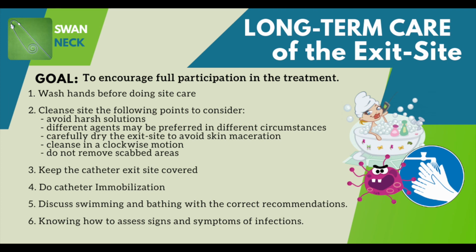To avoid torque movements at the exit site and reduce the risk of exit site infection, swimming and bathing can also be discussed with patients once the exit site is fully healed and ideally free from infection, with the following recommendations. A waterproof or occlusive dressing should be applied, and the exit site should be cleaned, and a new dressing applied immediately after immersion in water using the normal technique. Also, do not immerse the exit site in water without a waterproof dressing, particularly hot tubs, jacuzzis, and so forth. Diving should be avoided as this may put tension on the catheter at the exit site.